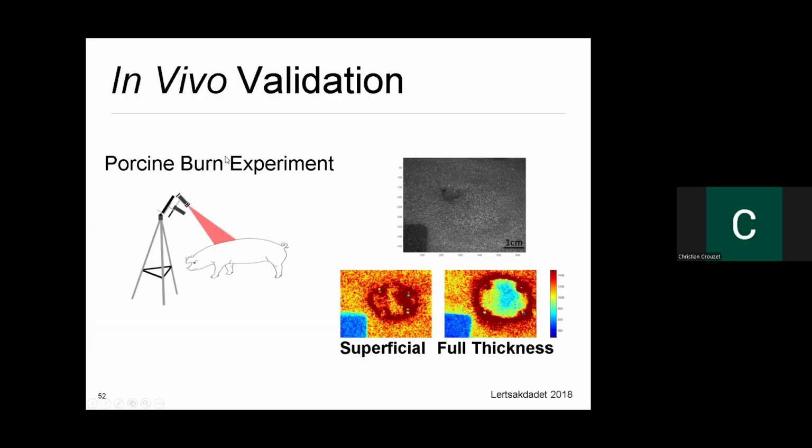is very important. Kind of going into some of the validation work using these handheld based systems, was using a burn wound model. Actually, my first projects in the lab were using burn wound based models to look at blood flow. And there's different classifications of burn wounds. Kind of the two extremes are superficial, which is kind of like a sunburn. If you ever have had a sunburn, it's pretty uncomfortable. But typically, you would have an increase in blood flow when you have a sunburn.